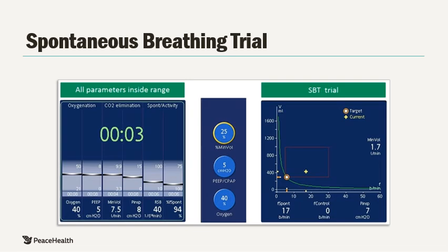During this period, whichever example you choose, extubation is acceptable if the patient is meeting all 6 criteria and meeting all our facility's requirements for extubation at any percent minute volume below 100%.